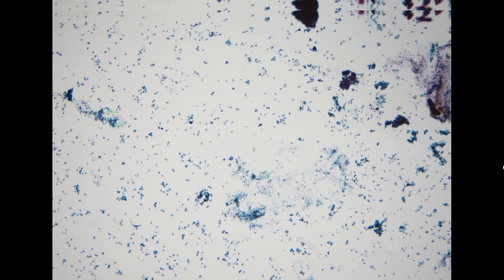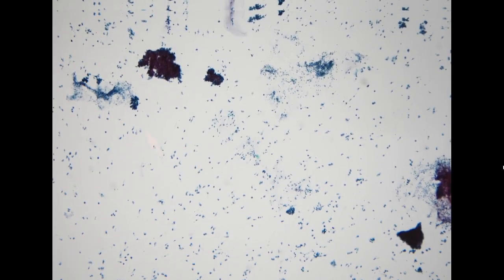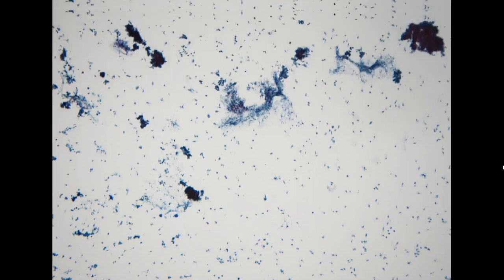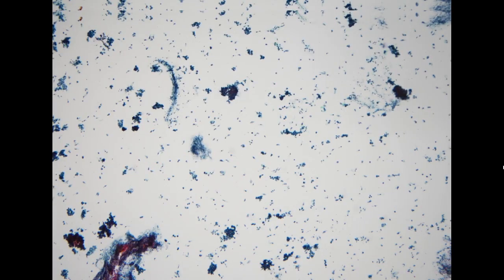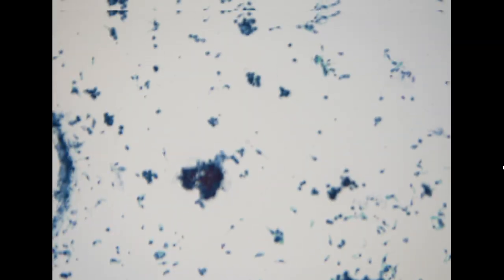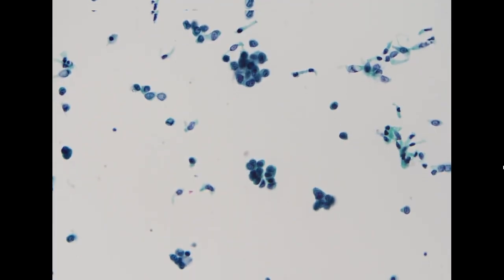Because it is a washing specimen, we expect to see hypercellularity, and some of the cells are in fragments instead of just individual cells. This is common in washing cytology specimens because of the washing force. We would expect to see cells in fragments. So this is a hypercellular specimen as expected. The key diagnostic point is to identify cytomorphological features of a high-grade urothelial carcinoma.